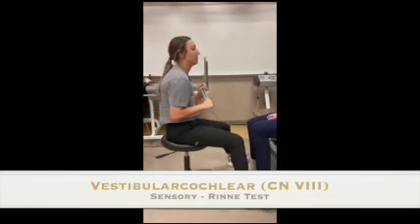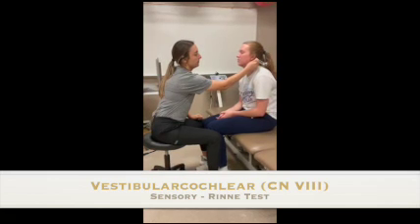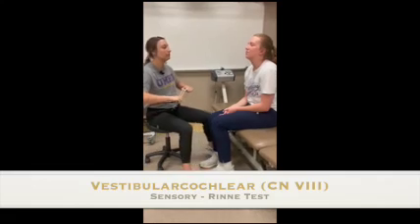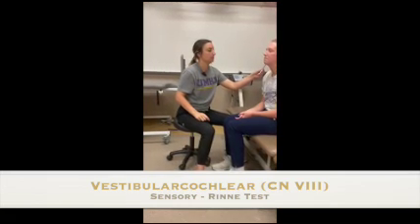is louder. We're going to do the Rinne test. So I'm going to go ahead and have my patient close their eyes again. I want you to let me know which one is louder. Number 1, number 2. 1. Okay. Number 1, number 2. 2. Abnormalities would be if the patient hears bone conduction louder than air conduction.